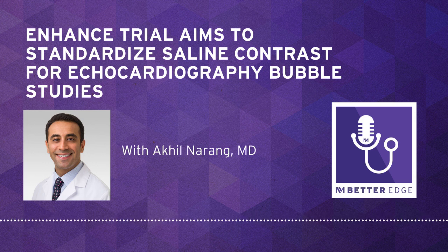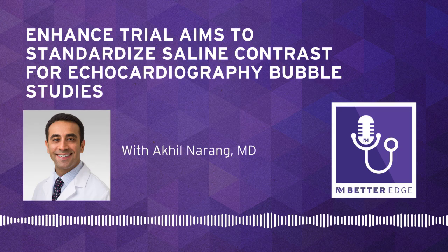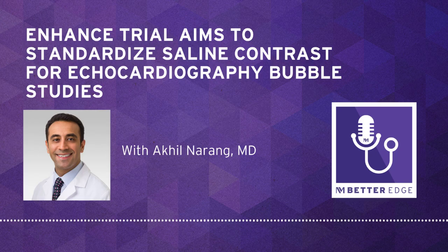So how quickly the bubbles are agitated, it requires multiple people, it creates non-uniform bubble sizes. And so the current process relies on separate techniques such as coughing in order to enhance the opacification of the right side of the heart and improve detection of the bubbles into the left side. The problem with what I mentioned is the non-uniformity that we have in current practice. And so the ENHANCE study aims to investigate a new device that will standardize saline contrast for echocardiography.